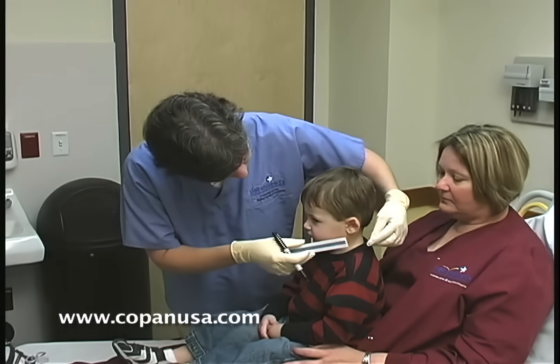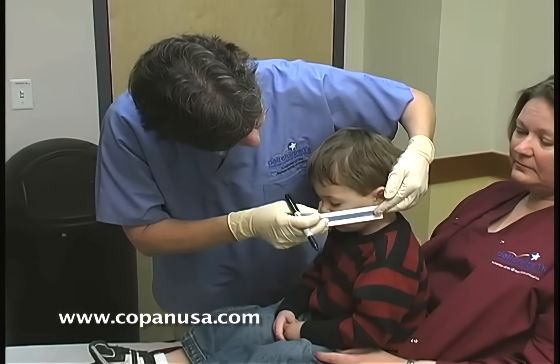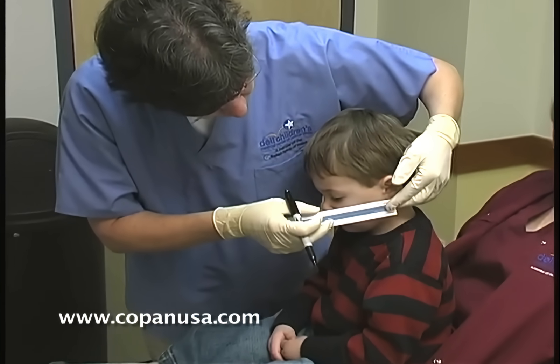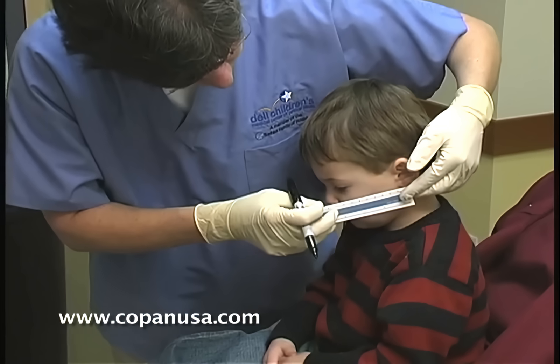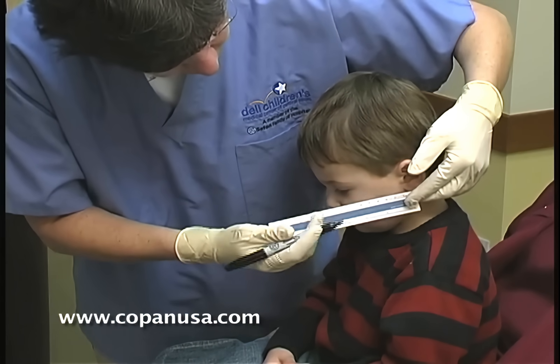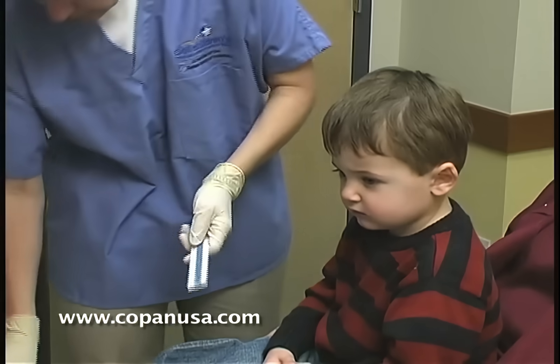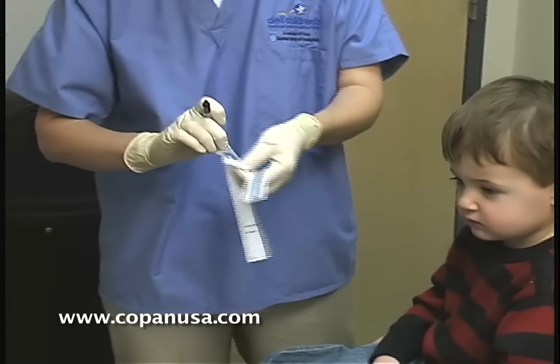What you would do is take this old disposable ruler supplied by Copan. You're going to put it at the child's earlobe and measure from there to the base of the nose. On Mr. Rowling here, that is right at seven centimeters right there. Then we will open our swab package.